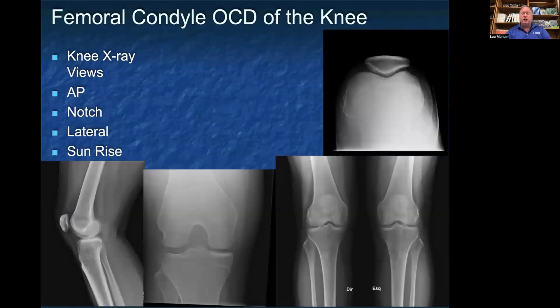The second location for OCDs in the body that we see is the femoral condyle OCD in the knee joint. On the knee, we typically get four views: an AP view, a notch or tunnel view, a lateral view, and a sunrise view. You want to get these weight-bearing as well because it provides additional information. Your sunrise view is in the top right, lateral view is in the bottom left, to the right of the lateral view is the tunnel view, and in the far bottom right you can see an AP view where we see both knee joints at the same time.